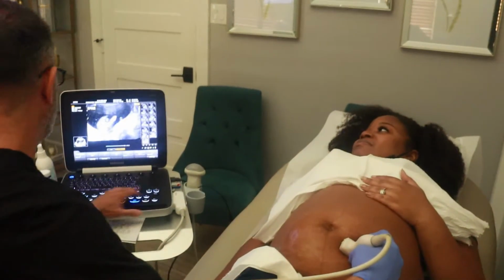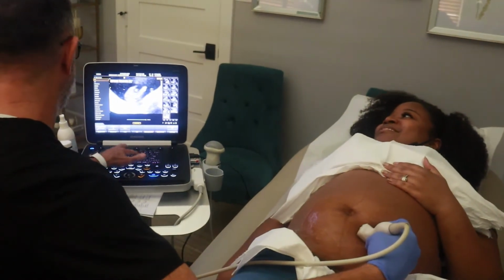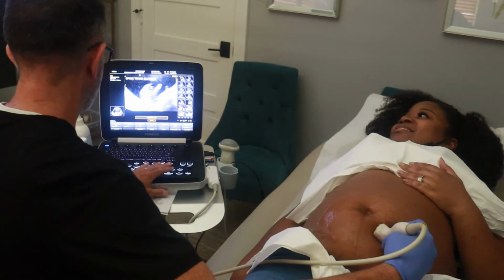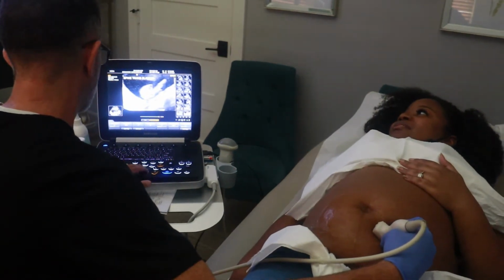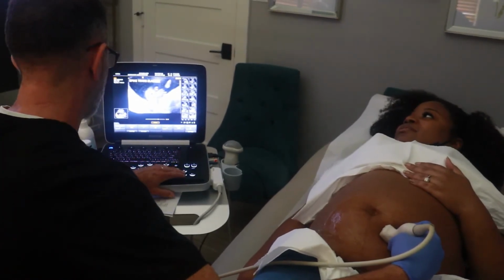Something just blew up. What's that? This is the pelvis, showing a little bladder right there. A little bitty, little dark circle right there is the bladder.